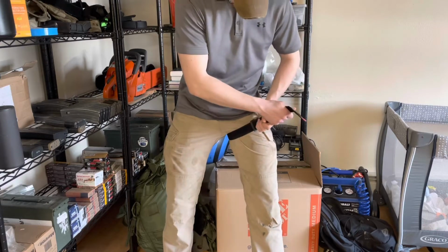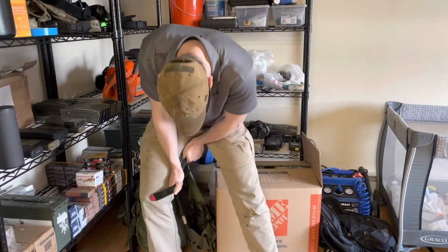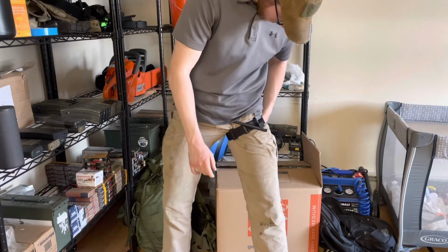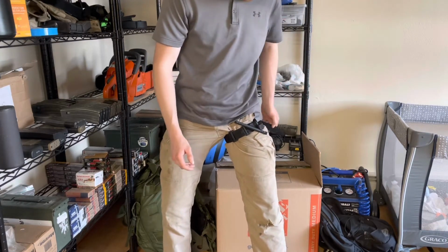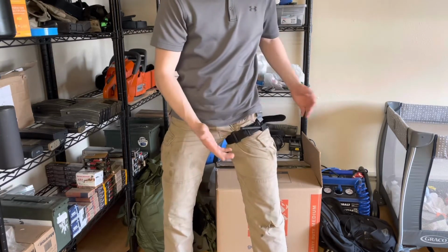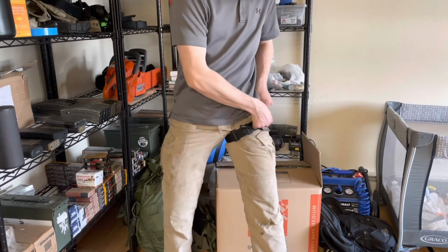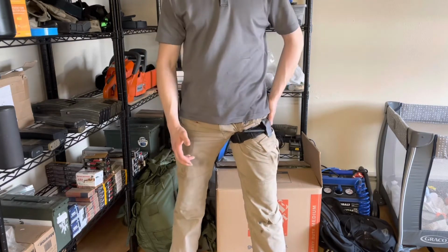So on initial tightening, you want to get it as tight as you can, like I said, and then at least get your strap mostly secure. If you don't want to take the time to fully get it in there, I get that, but make sure when you're done with tightening your windlass, you do. So let's say it's tight. I'm not going to tighten this one because this is a carry tourniquet for me. Once you get that secured, make sure you go ahead and run this and get your full secured tourniquet.